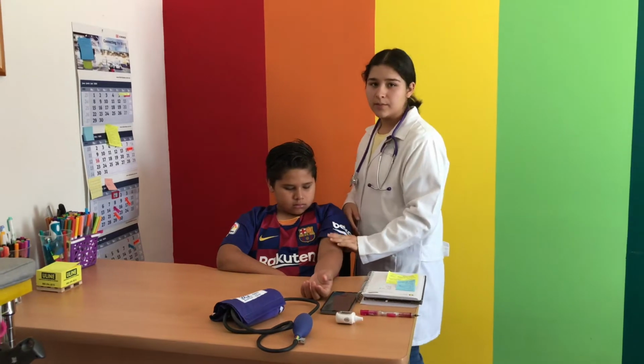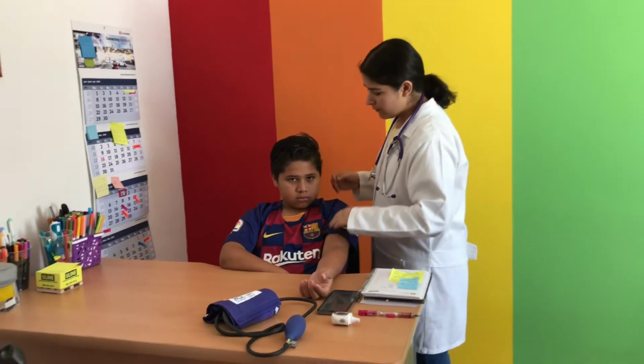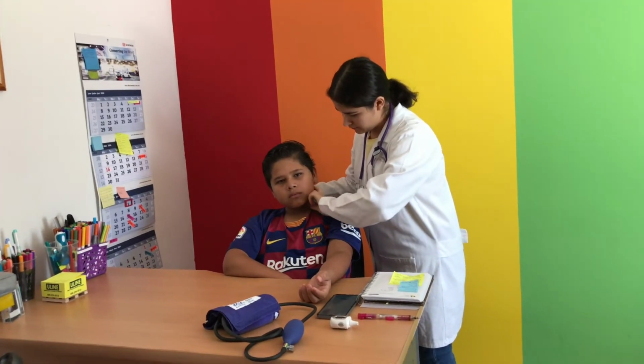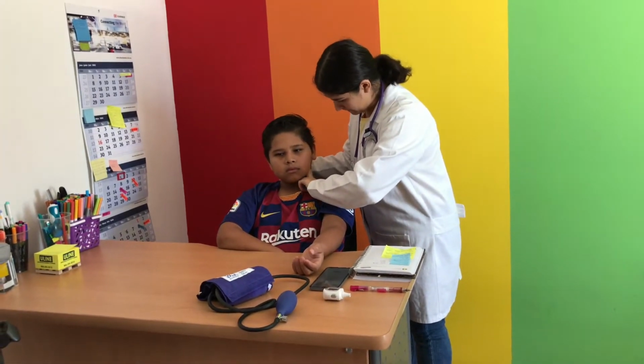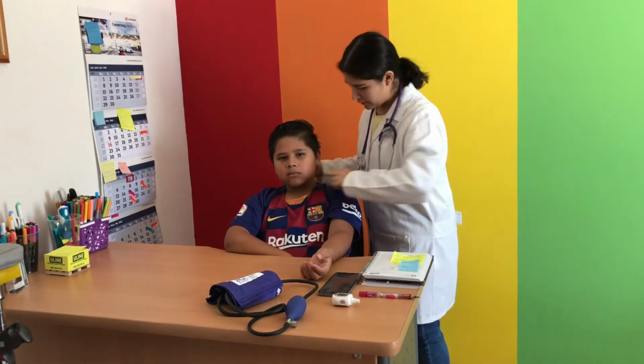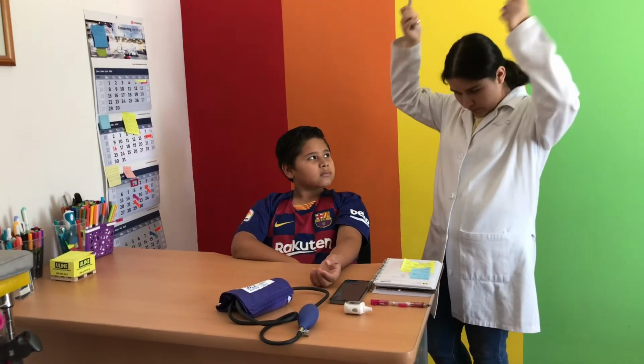I can feel it a little bit here in the brachial, but it won't be accurate. No, I'll be using the stethoscope instead.